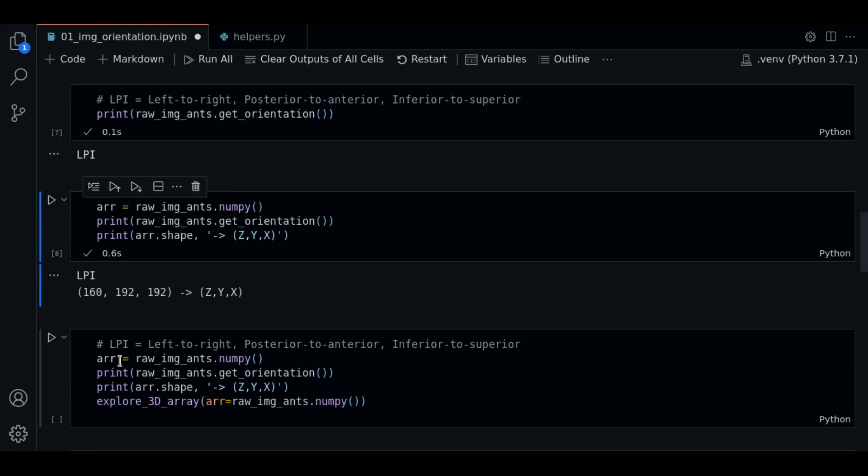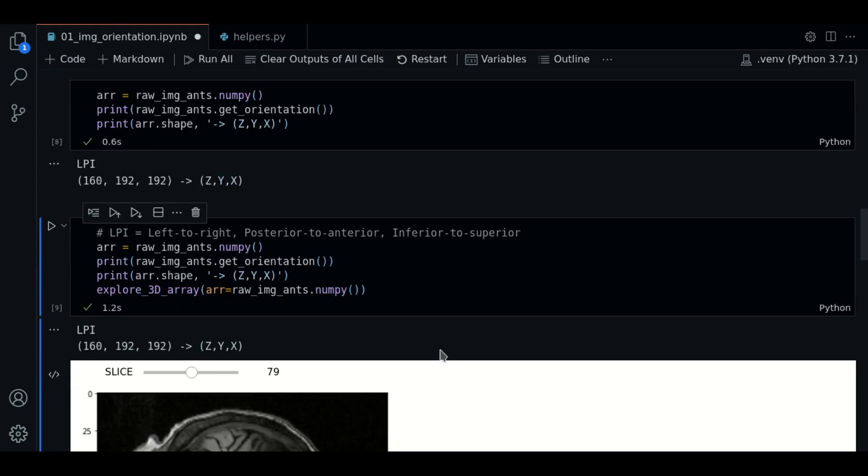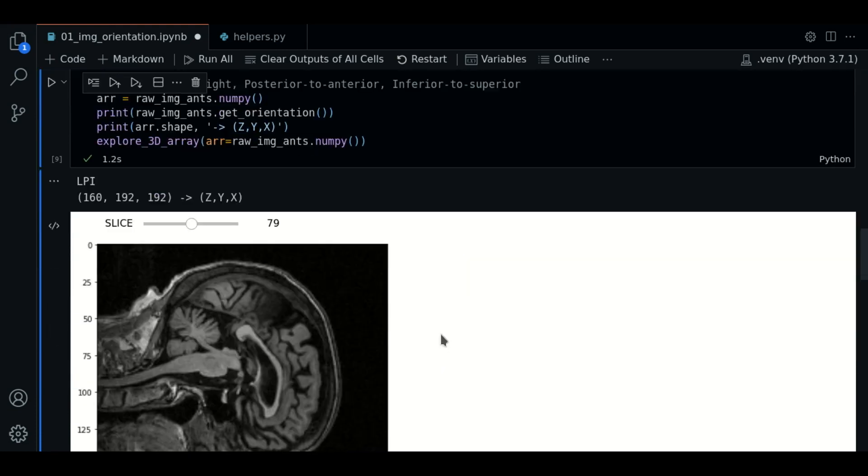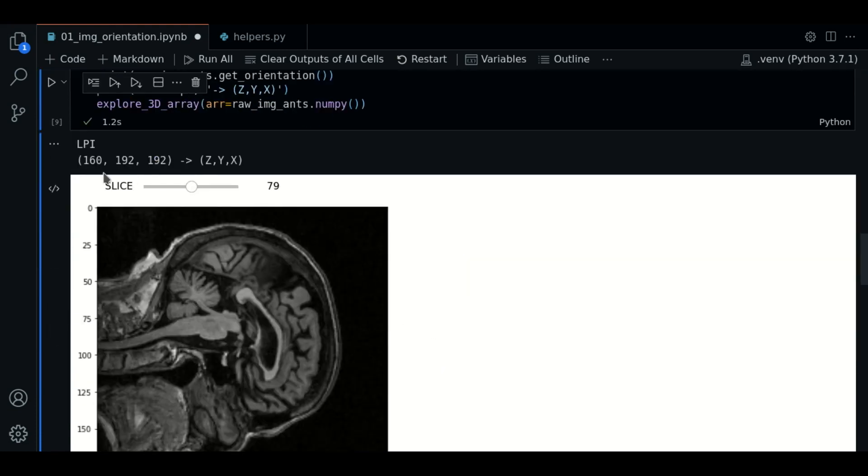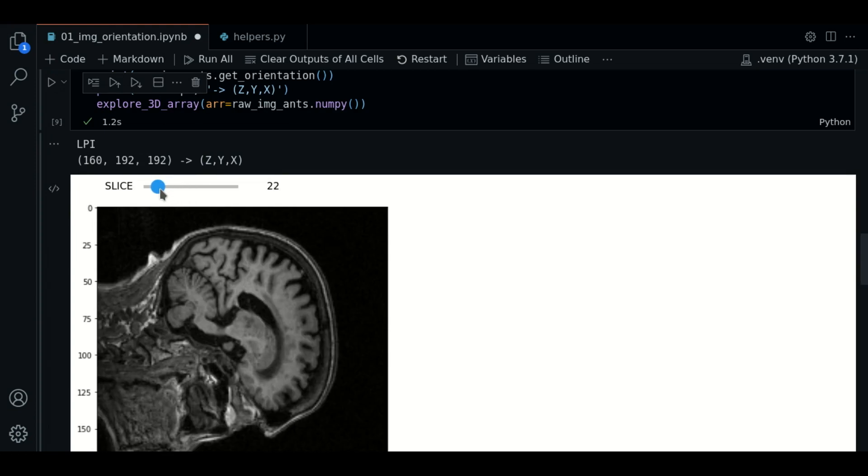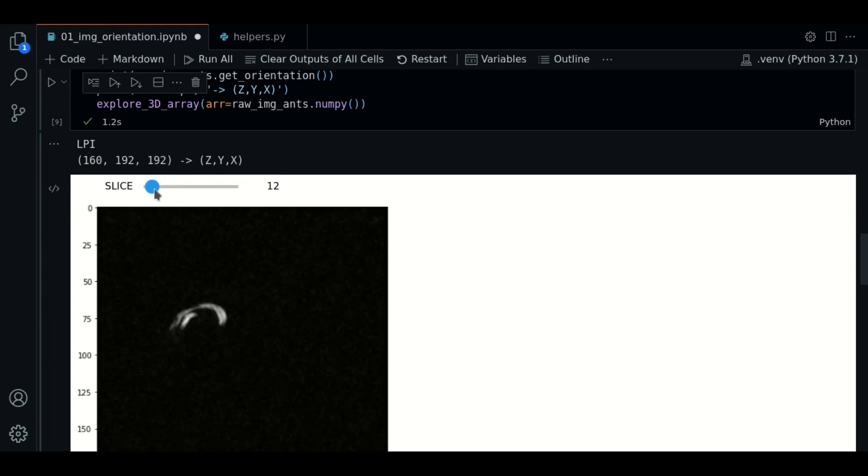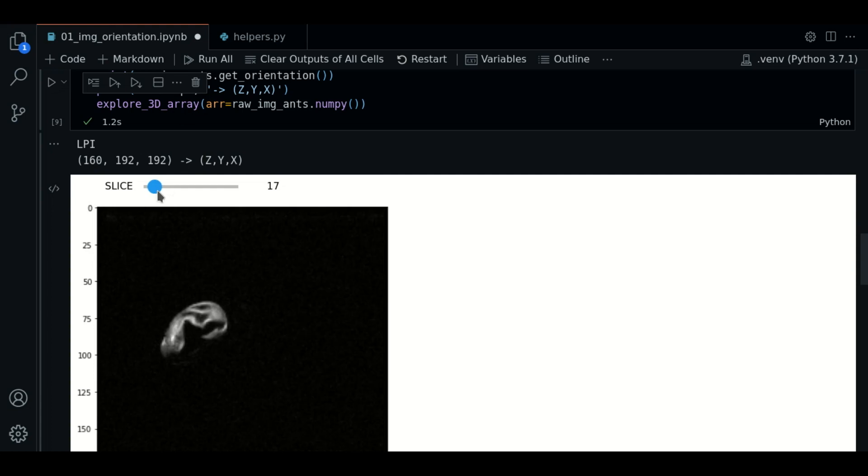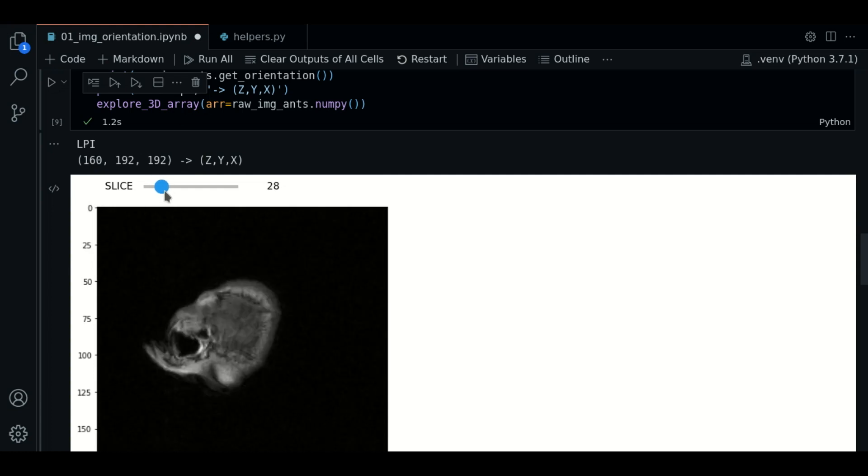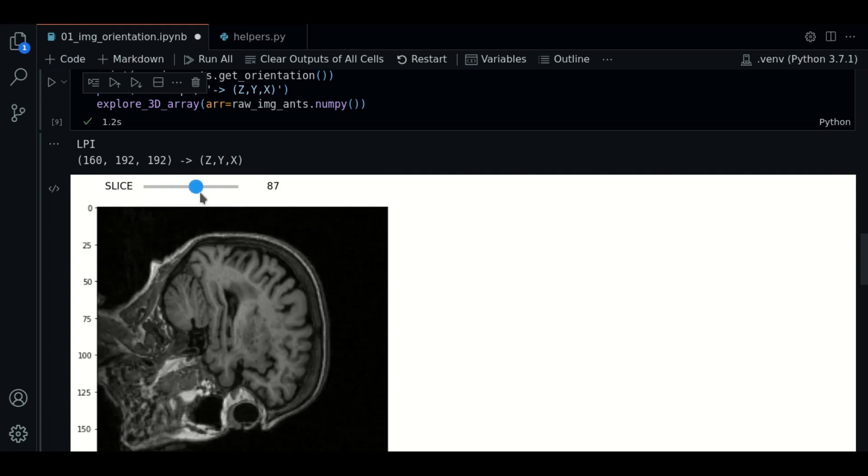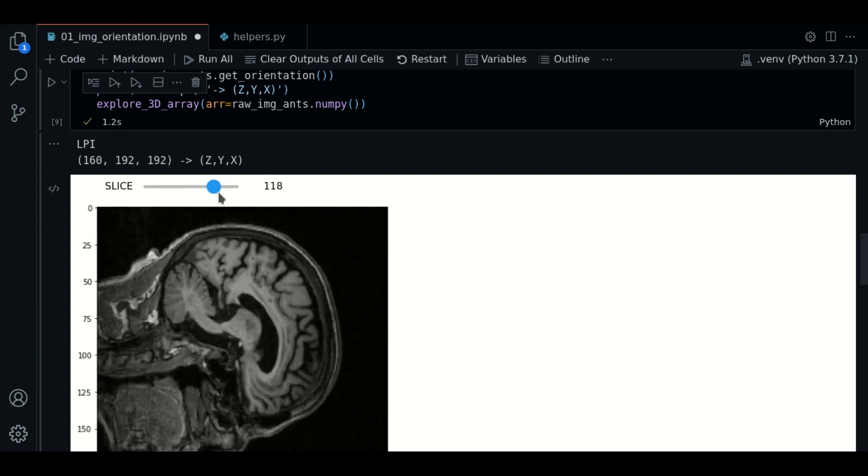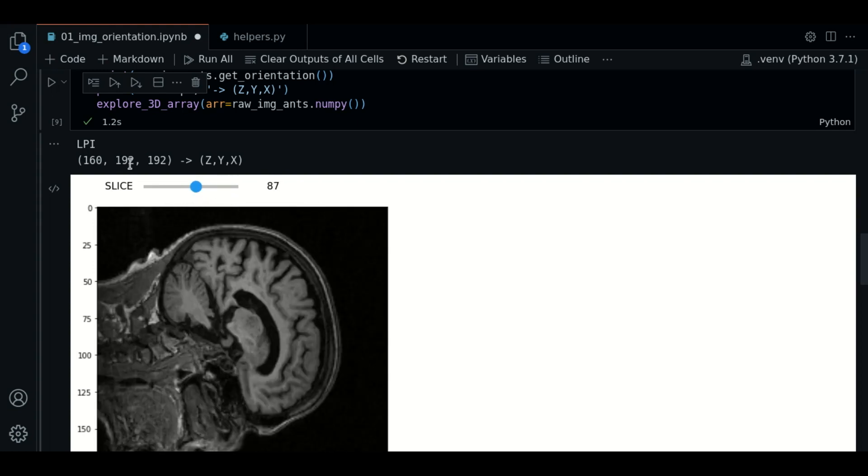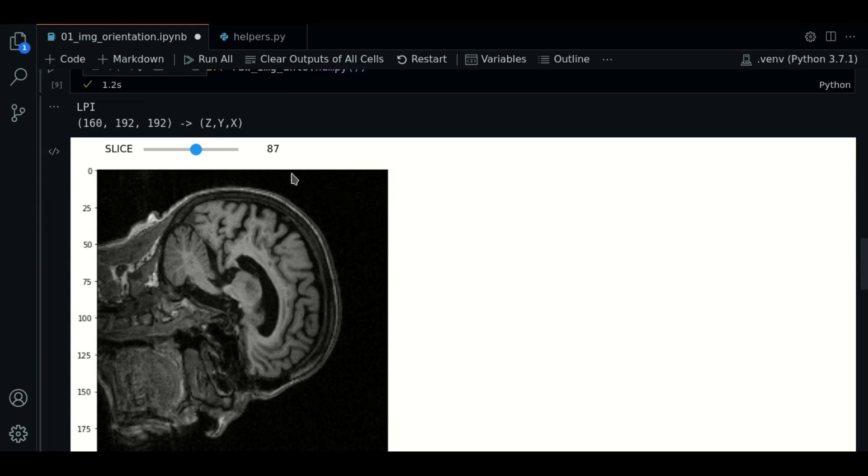Let's add the plot of the image in the comparison. We press enter and we get the image. If we go along the first axis, we can confirm that the first dimension is going from the left of the head to the right side of the head. So that covers the first axis.